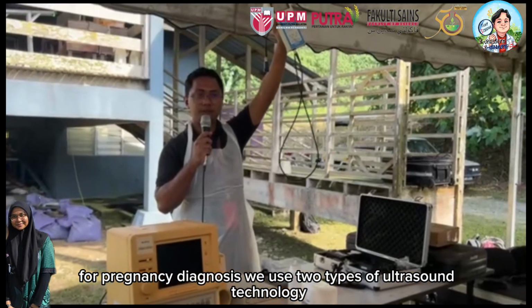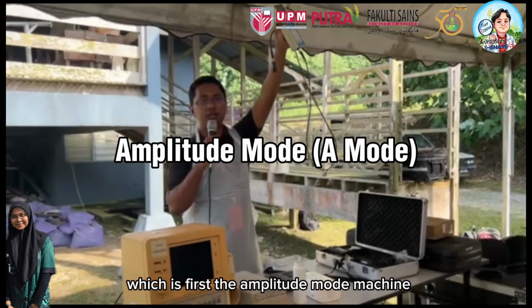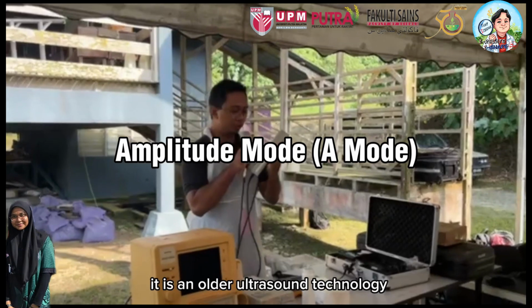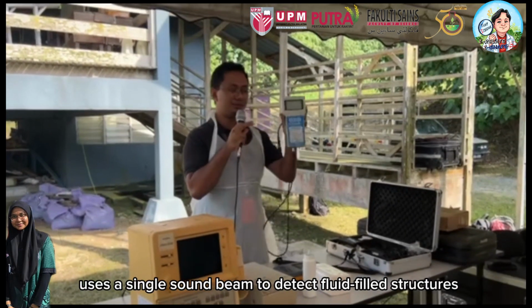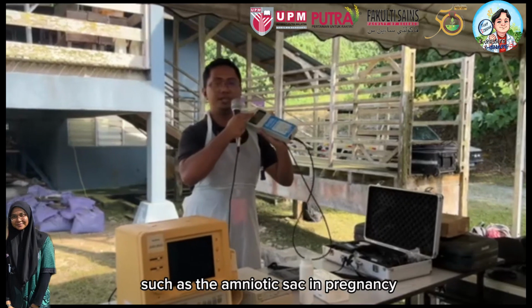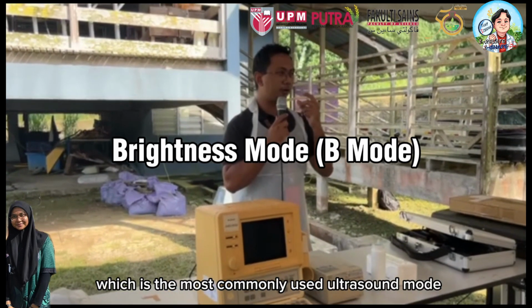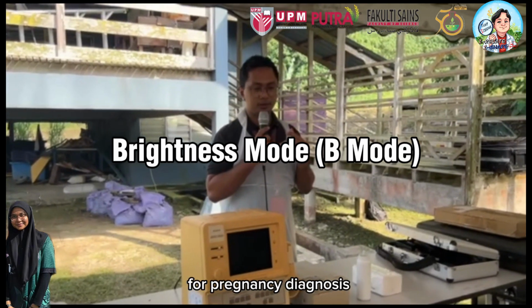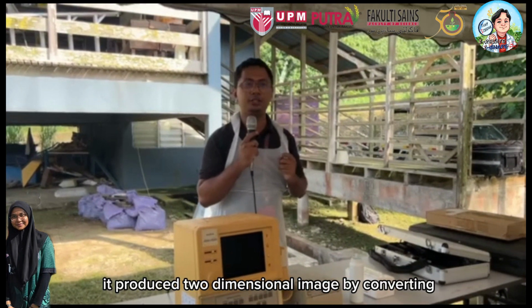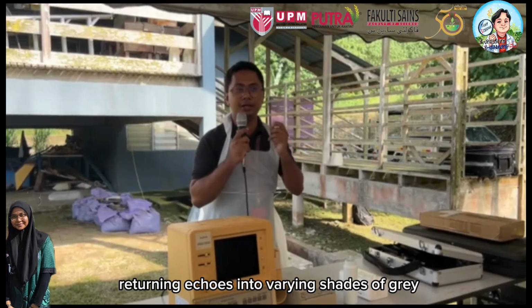For pregnancy diagnosis, we use two types of ultrasound technology, which is first the amplitude mode machine. It is an older ultrasound technology, uses a single sound beam to detect fluid-filled structures, such as the amniotic sac in pregnancy. The second machine is called the brightness mode machine, which is the most commonly used ultrasound mode for pregnancy diagnosis. It produces a two-dimensional image by converting returning echoes into varying shades of grey.